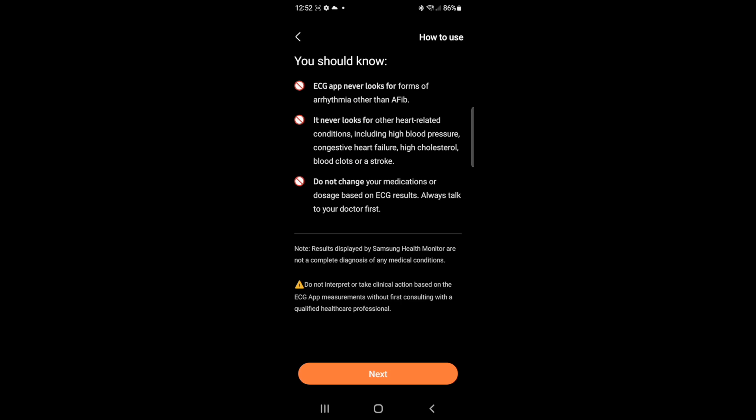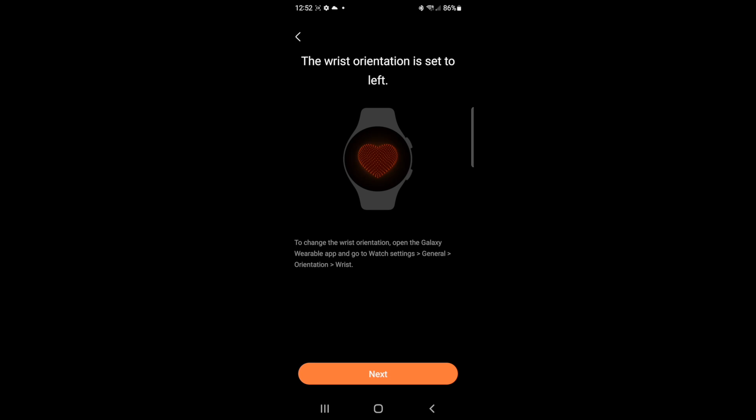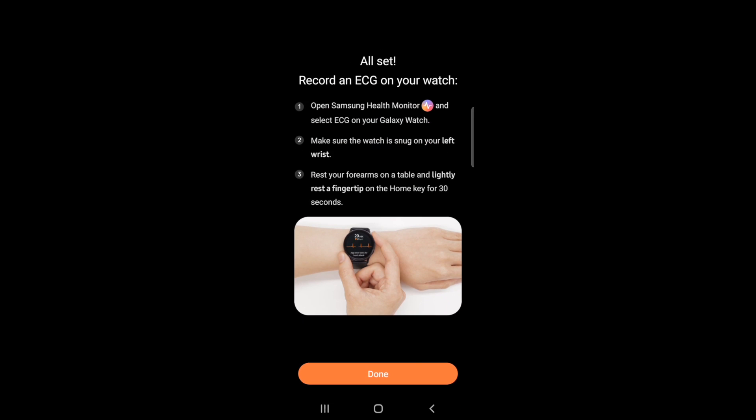Once it's set up, Health Monitor will update, apply everything, and set everything up so that you can then calibrate to get the ECG going. It's not a hard process — it's actually quite easy and you should be up and running in no time.